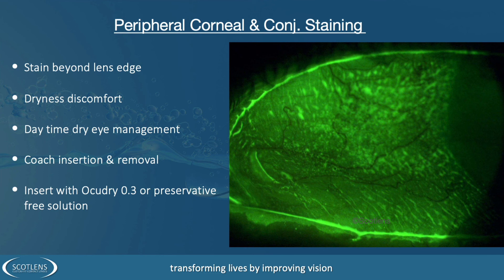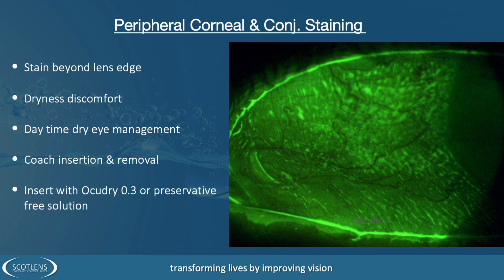Looking onto the conjunctiva beyond the cornea, in this case we can see this patient has a history of lid issues — there's a notch in the lid caused by an old meibomian gland cyst. This patient has general diffuse staining on the conjunctiva. At this point we want to move them onto preservative-free solutions and maintenance of dry eye management during the day.